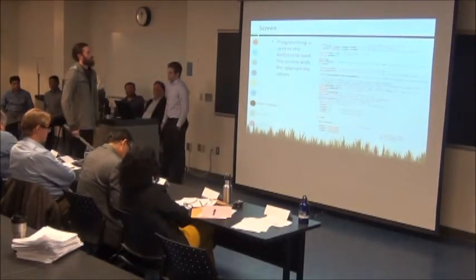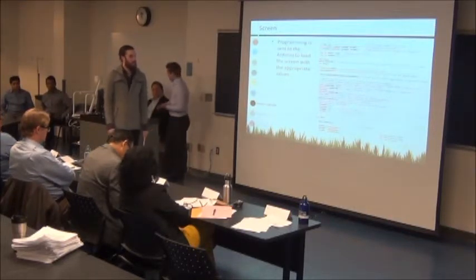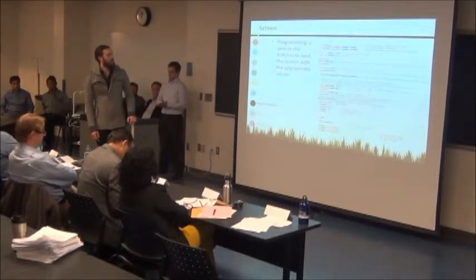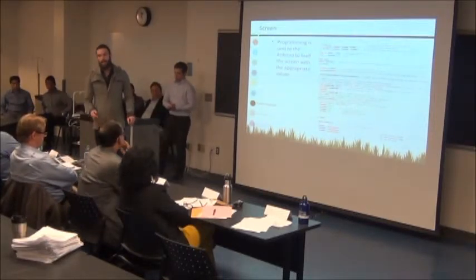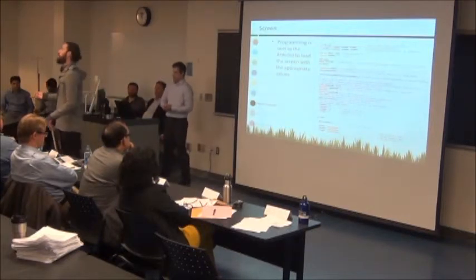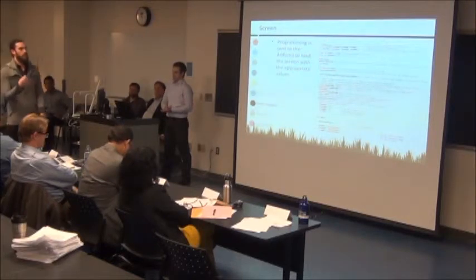So this is the code. This is Arduino coding. Again, I worked on this with Tom, mainly his creation. The screen will load this, and it basically looks at the Arduino. The Arduino says, do this, do this, do this, over and over again. And as it rolls through the coding, it will output on the display.